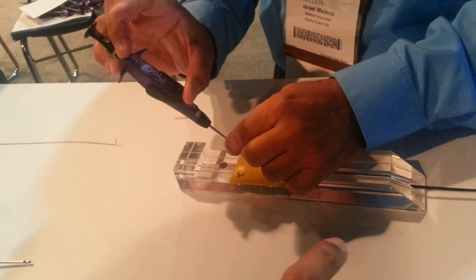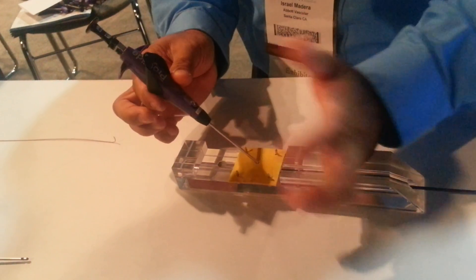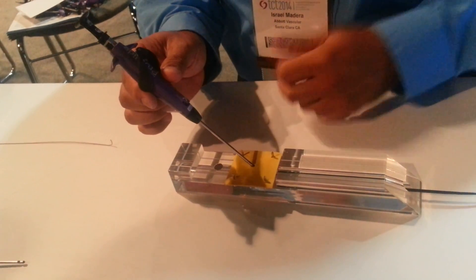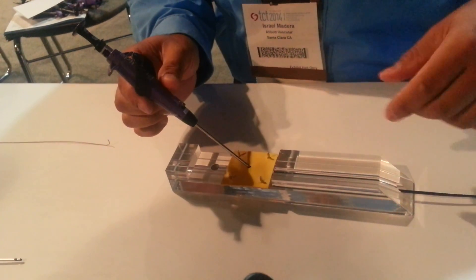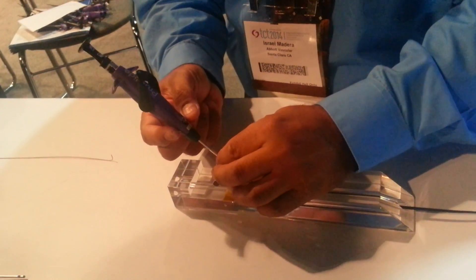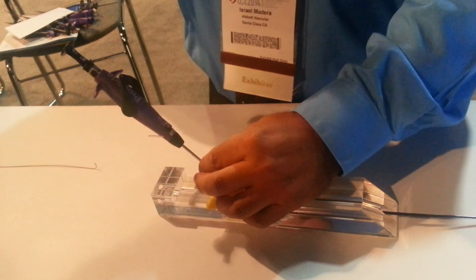Once you have pulsatile flow — see how I'm holding it with one hand over here? 45 degrees. I have pulsatile flow, I'm good to go. I'm going to go ahead and see this number one — it's called the foot. I'm going to gently, with the other hand, pull. All I want to do is make sure that I'm up against the arterial wall. What you'll notice is you will not have any pulsatile flow, or you will have minimal — almost nothing — because you're blocking that hole.